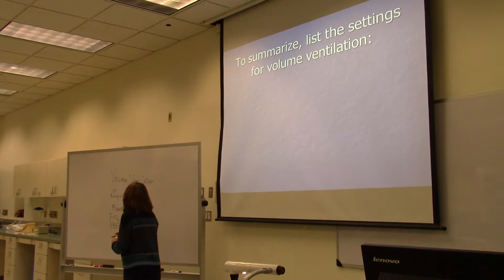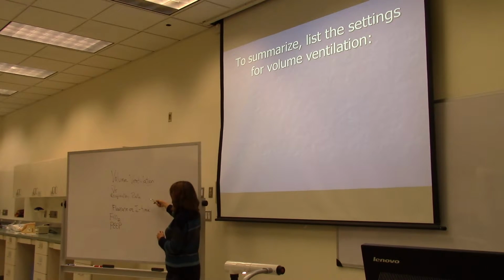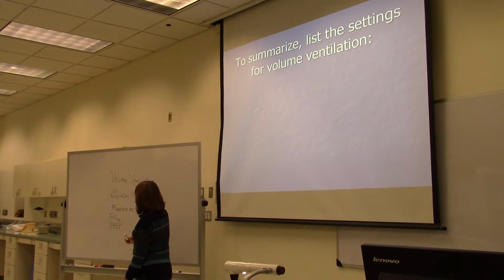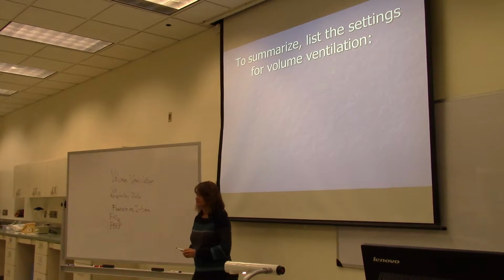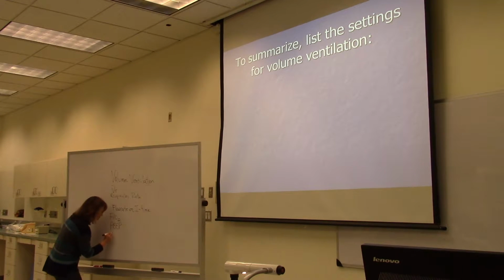Sensitivity. So, tidal volume, respiratory rate, and then of course we have to tell the ventilator how fast to push the volume in. FiO2 and PEEP. Just sensitivity? Okay. There's a few things we gotta do.